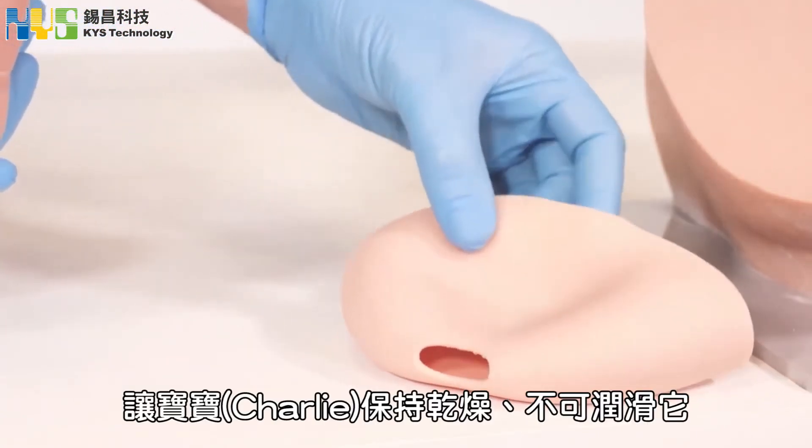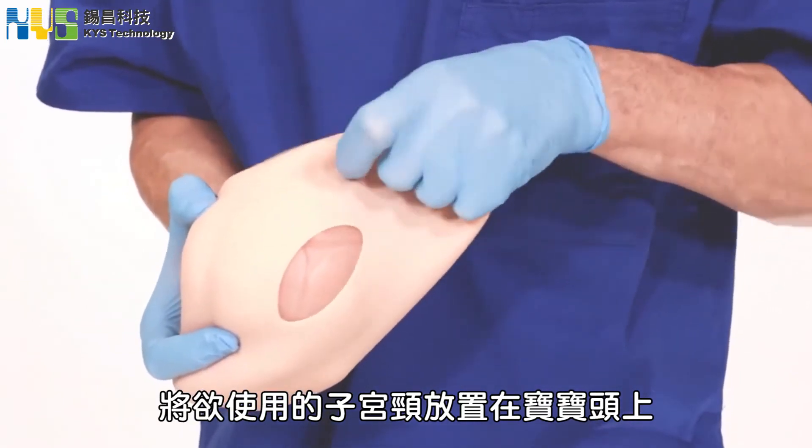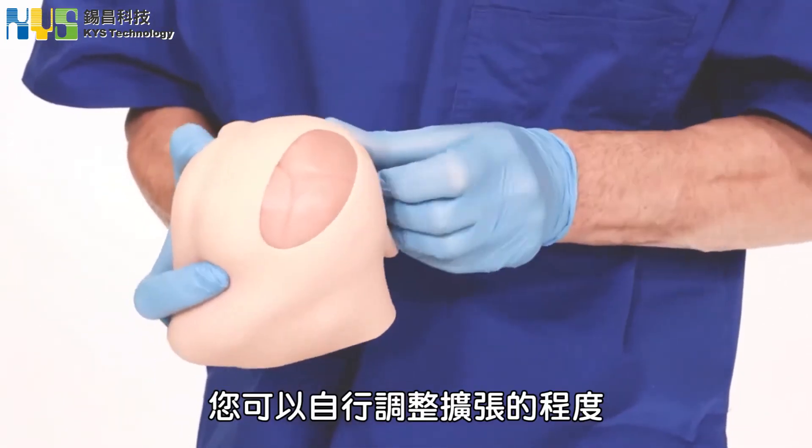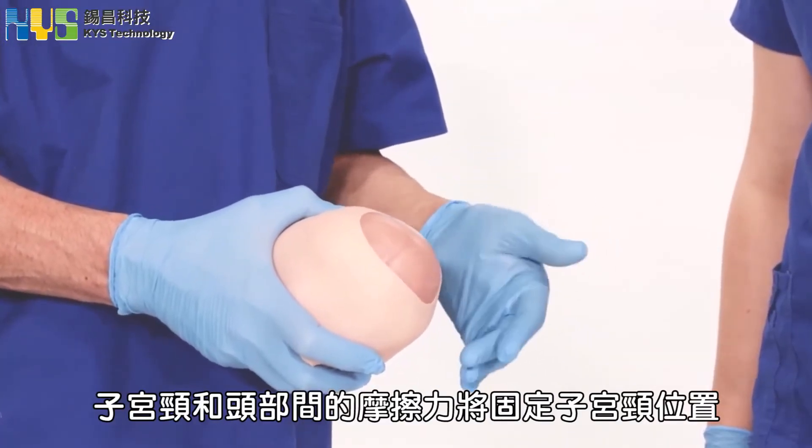Take Charlie's head dry — do not lubricate it. Place the cervix you wish to simulate over the head, then choose a level of dilation. The friction between the rubber and the head will hold the cervix in place.